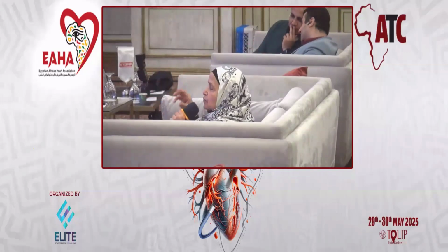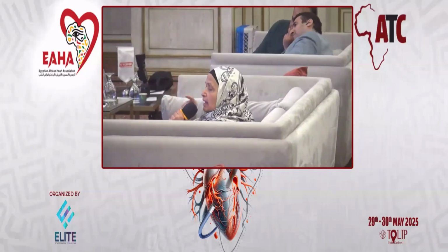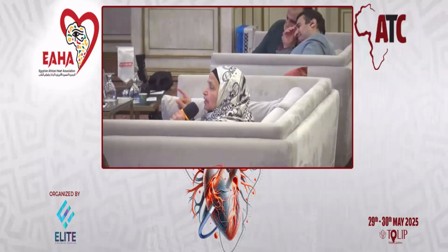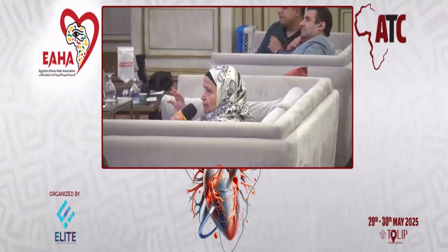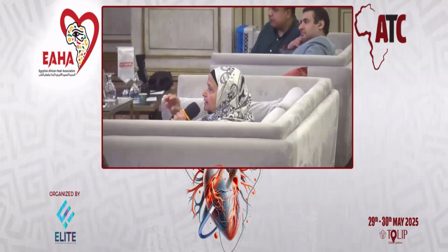Then you ask him, did you have any syncope and did you recover? If you find such a patient receiving multiple shocks and he's still alive, then you have to think of inappropriate multiple shocks. This is my interpretation when you put the data or the facts of the machine together with the clinical situation of the patient.